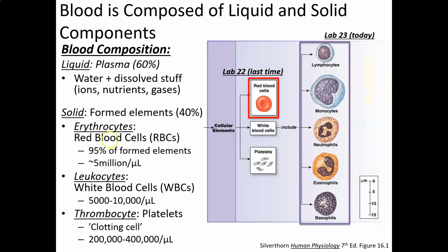So when we look at your white cells, you can divide your white cells into a couple categories. The white cells we can generally divide into what we call granulocytes and agranulocytes. Granulocytes have granules in the cytoplasm. So in these drawings here, they're not photographs, they're just drawings. You can see all the little dots. So this has got granules, this one's got granules, and this one's got granules. So we see three of the cells that have granules. This one, it's hard to tell. It sort of looks like it has granules. That's not granular, and this one is not considered to be granular.